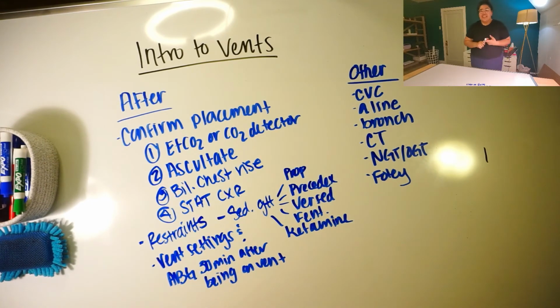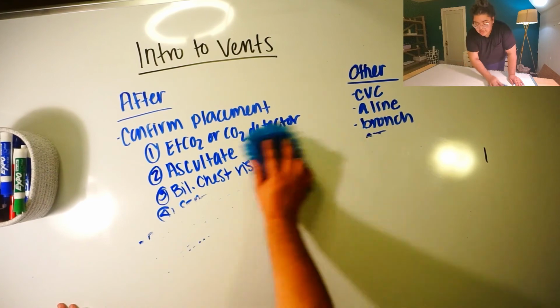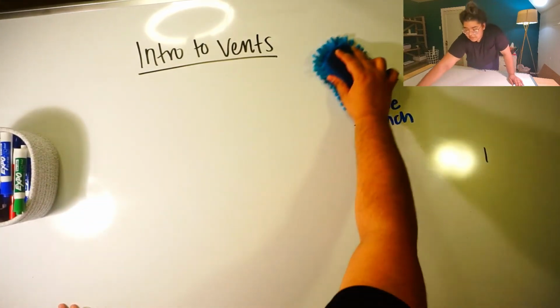We're in charge of placing the NG tube and the Foley. So just get your supplies. If you know what you're going to be doing afterward, just get as much as you can. Okay, but if not, don't worry about it. So you can leave the room and it's all good.